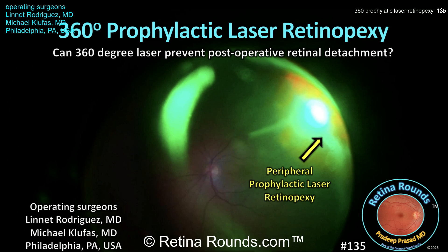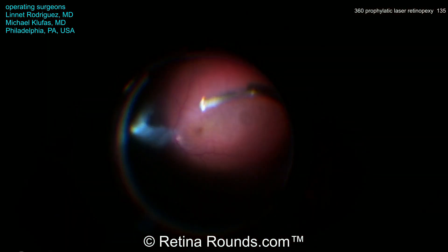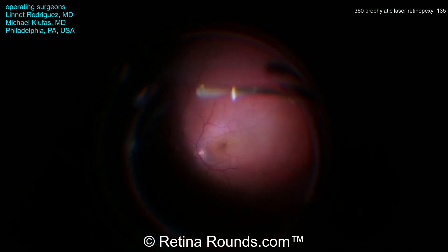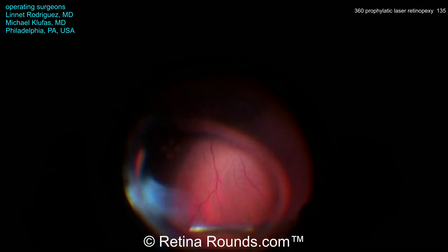Let's see how the case goes, and at the end we'll review some of the literature on the topic. Thank you, Dr. Klufus, for sharing this case. You can see that this is a 25-gauge pars plana vitrectomy, and this patient has a multifocal lens. It's not uncommon for patients who have multifocal lenses to complain of symptomatic vitreous floaters.